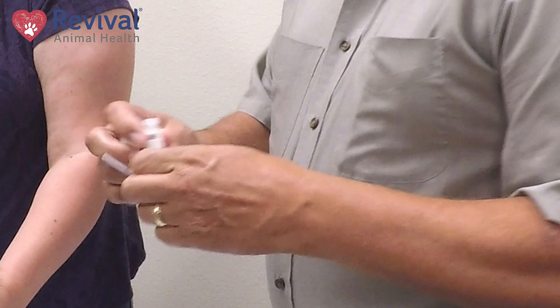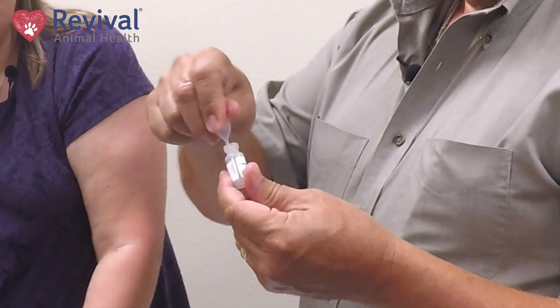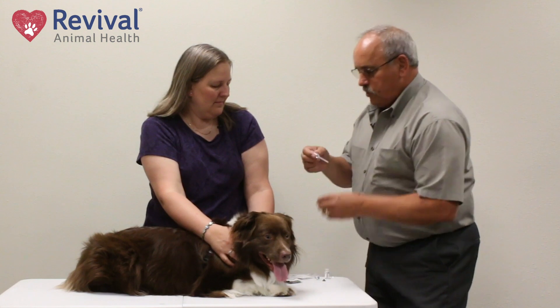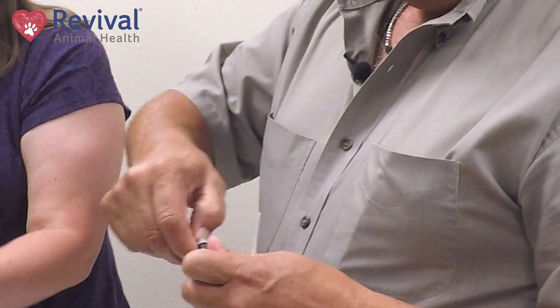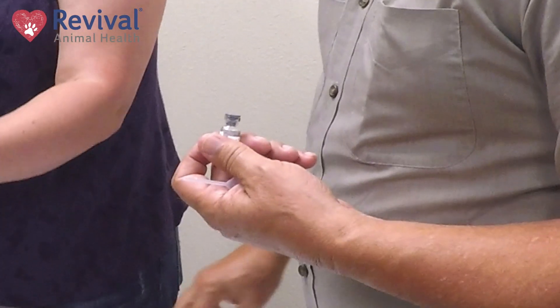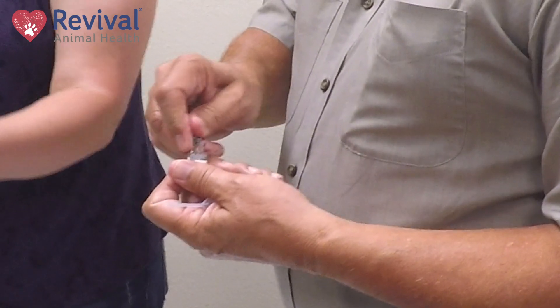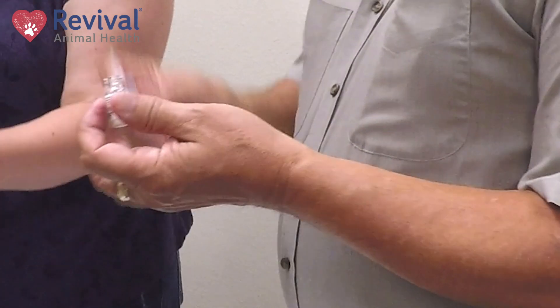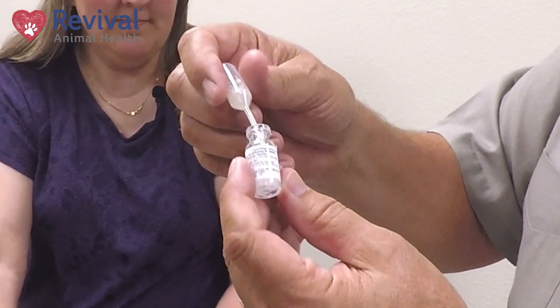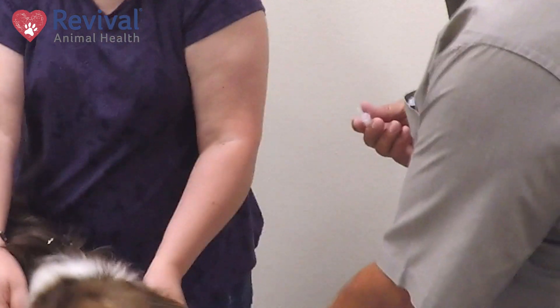With the small bulb syringe you can suck this liquid out — it's just buffered water, and it's only going to be about a half cc to a cc. If you have a really tiny breed you can use half the diluent and that's fine too. Then open up your virus and bacterium, which is in the freeze-dried powder for stability. Put the liquid into the powder, swirl it, and it'll go into solution very quickly. Then just suck this up into the bulb syringe and we can administer it into the nose.